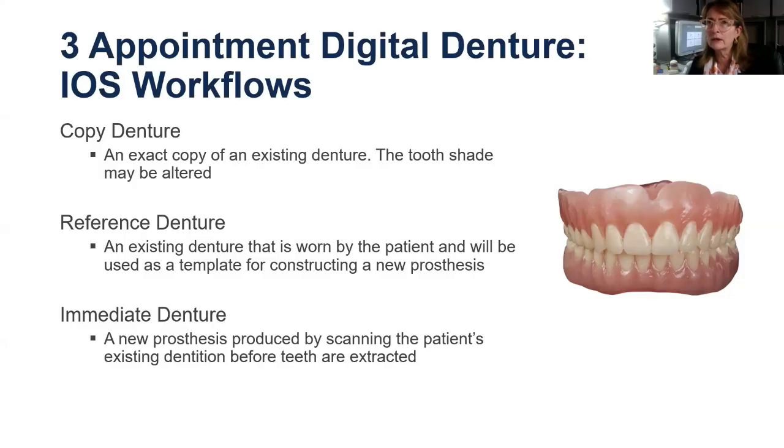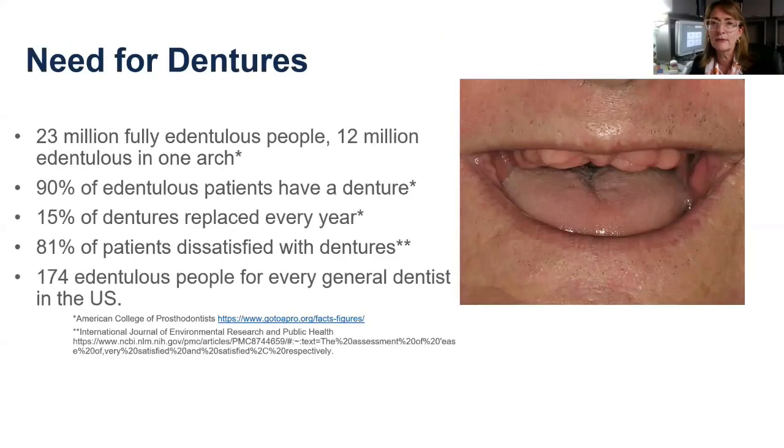Really creating, or taking the measurements to provide to the laboratory what vertical really is. You could do a mush bite as well. Most dental laboratories don't get really excited about receiving mush bites. I'll be honest with you on that. But let's get back to our data a little bit here.